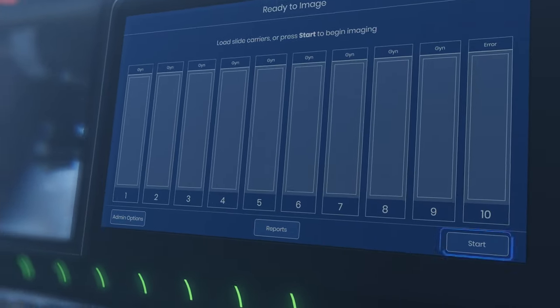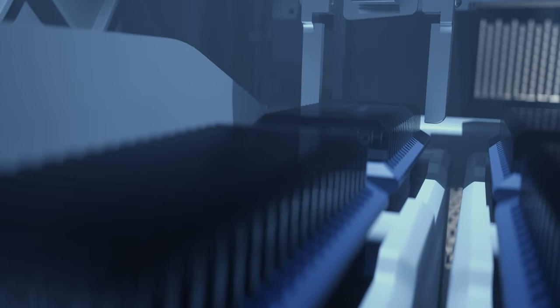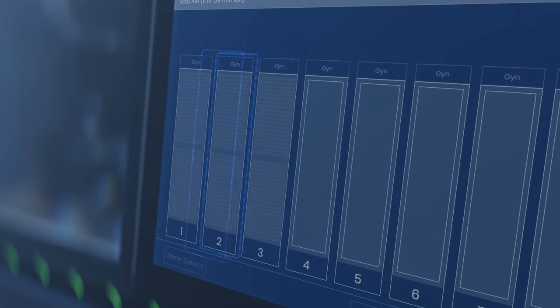On the touch screen interface, press start to initialize the system. As each carrier is being processed, the system takes a slide inventory and displays it on the screen.